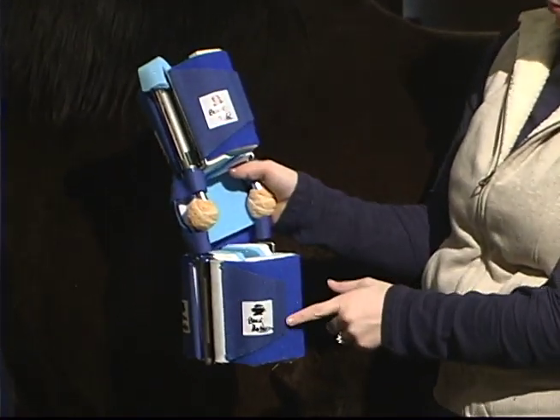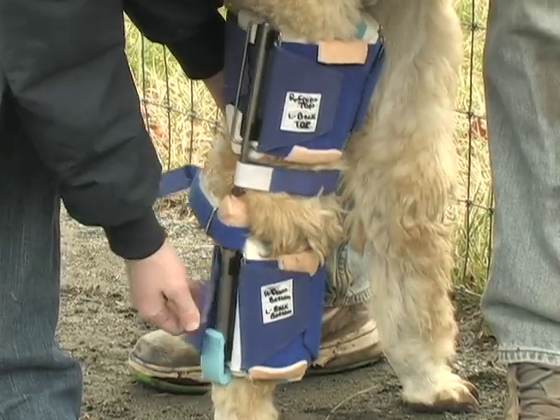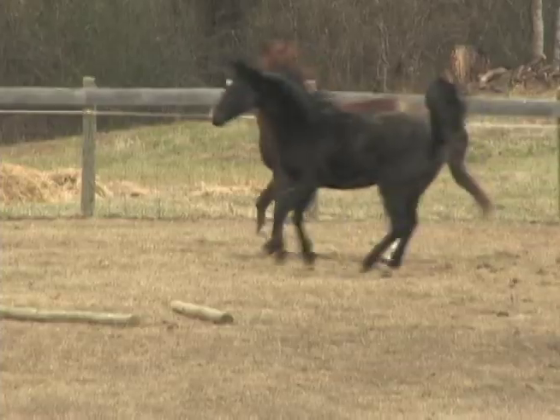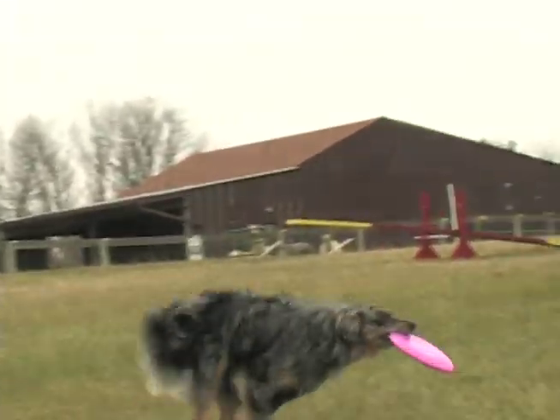Hello, and thank you for choosing Dynasplint Systems. The following video is designed to help you identify each component of the Dynasplint, demonstrate the fitting process, and provide a general review of the treatment protocol. Please remember that just as each animal is unique, so is each treatment. This video is only a guide and should not replace the assistance of your Dynasplint consultant.